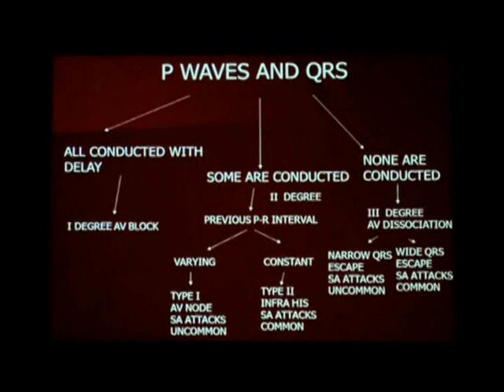I told you the approach. If you diagnose a fascicular block, always look for bundle branch block. If you diagnose bundle branch block, always look for fascicular block. If you diagnose bundle branch block and fascicular block, you must always look at the PR interval, because you may be diagnosing a trifascicular block. There only you have the importance of the PR interval. So remember: fascicular block, bundle branch block, associated PR interval. So if you have a right bundle branch block, left anterior fascicular block, with a prolonged PR interval, you are dealing with a trifascicular block. In that situation, it is an indication for pacing.